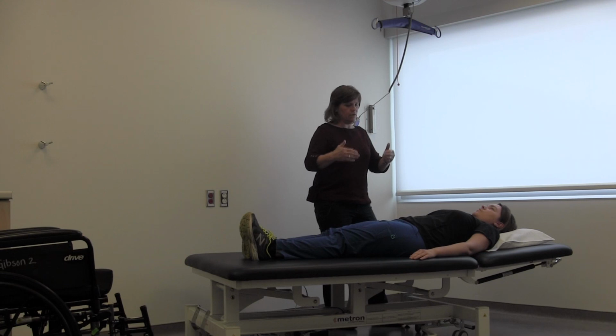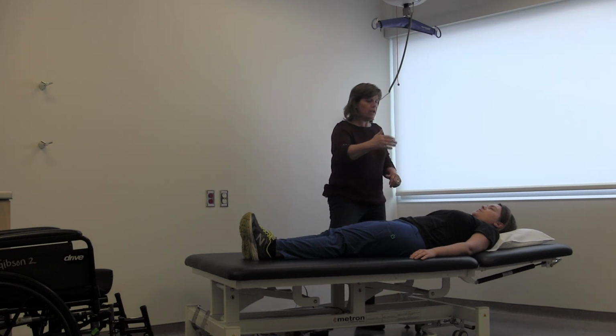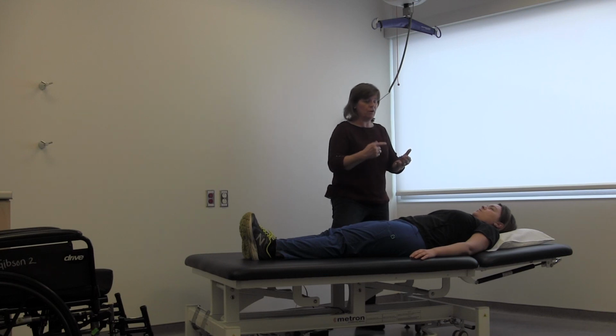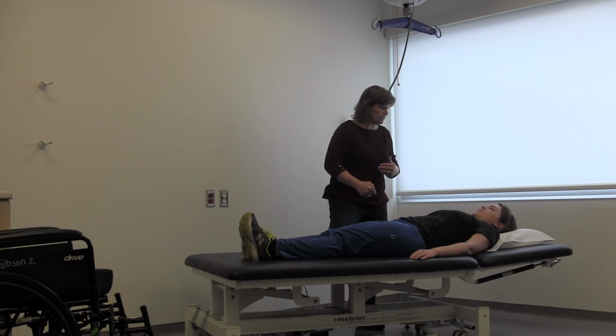So if Annette, if we want to get her up on the left side of the bed there, we notice that she's, and don't move, okay? She's a little close to the edge, and we know that if rolling her over and she doesn't have that rail, number one, she's too close to roll. We also know our patients who have proprioceptive deficits and fear of falling, that they won't complete their roll if they're too close to the edge. And I think we've all experienced that, right? So one of the things that we need to do is shift her in bed towards me or towards her right side a little bit to give her enough room to roll to that edge, okay?